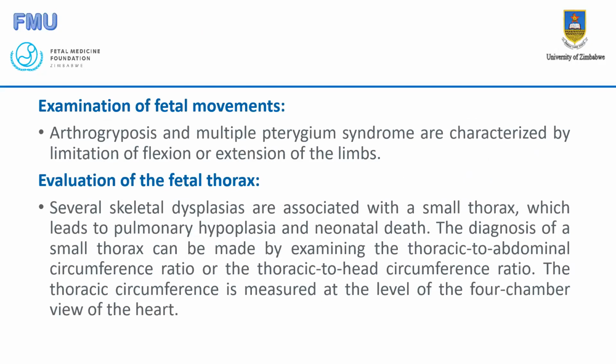babies have to move. And if the baby is not moving during your time of scanning, try to stimulate the baby to move. Babies can be stimulated even by simple tapping of the mother's tummy with your probe in a gentle way without harming the mother. And you should always communicate to the mother in advance so that she knows what you are doing, so that it doesn't look awkward to her. So always warn the mother that, look, I just want to stimulate your baby to get to see some movements, because it's part of routine assessment of the baby's well-being.